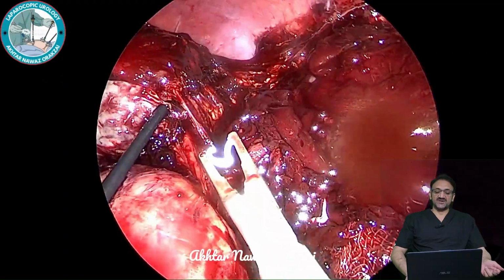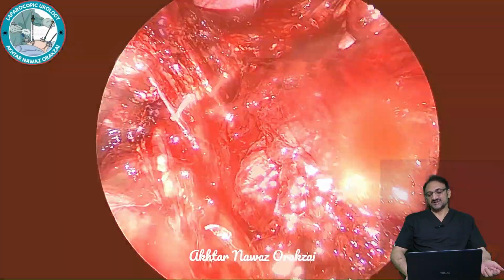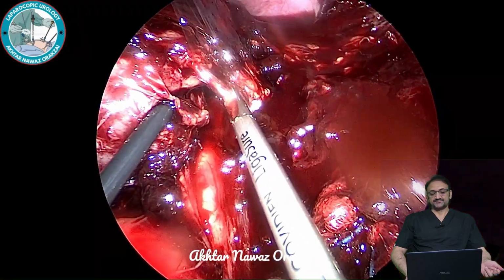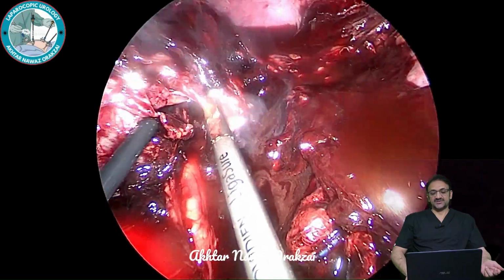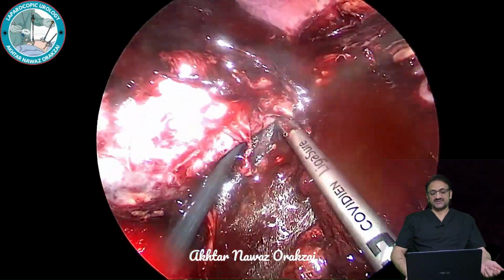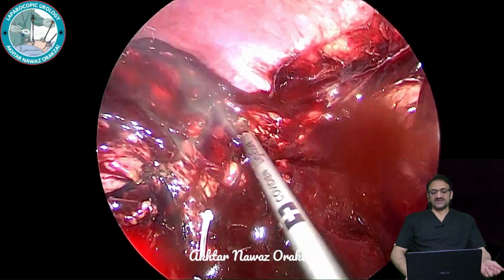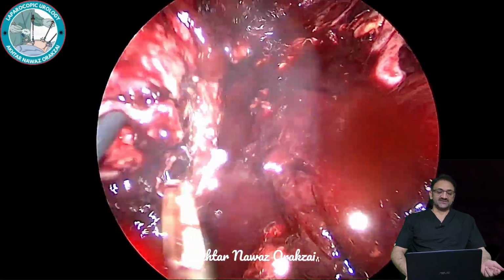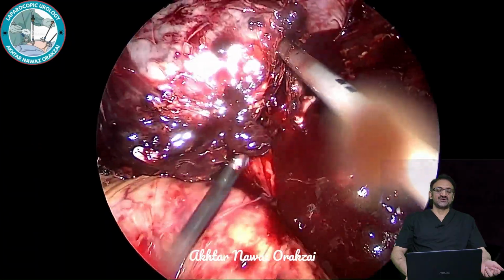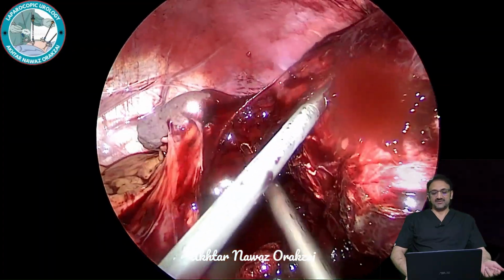Although 2 pints of blood have been transfused to the patient. There you can see another artery which is coming from most probably the aorta. So that has been clipped as well. And now I have to keep in mind the spleen, because dissecting it from this side may lead to splenic vessel injury. So I have to rotate the gland laterally to see where the spleen is. And then we will deal with this as well.